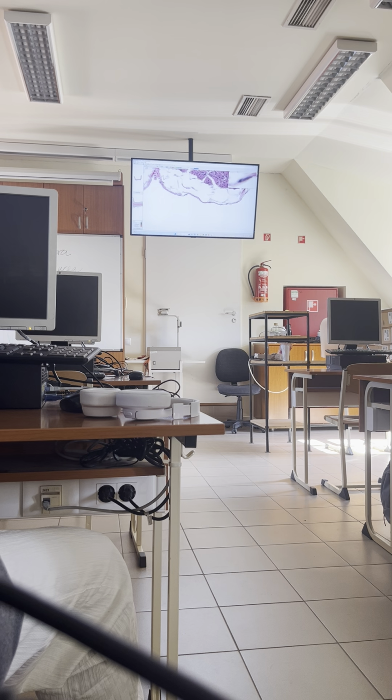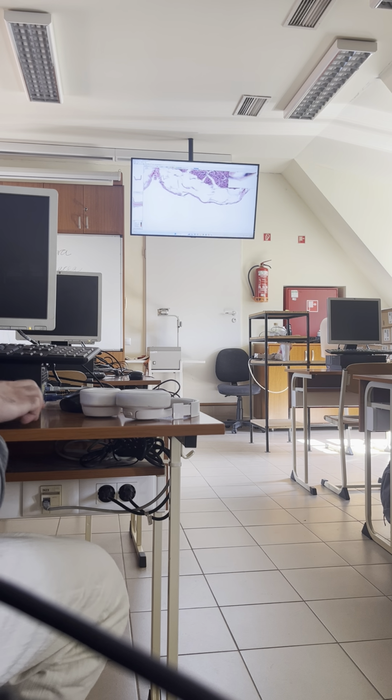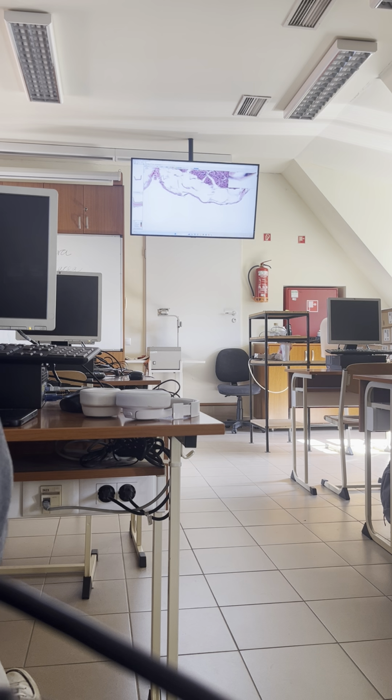If they are, then we can conclude that this is the serosa layer, and here the loose connective tissue is the subserosa. And at least in this part, the bladder had a peritoneal coverage. It's an infraperitoneal organ, so the apex is covered by peritoneum. And the extent to which it is covered is dependent also on the fullness of the bladder.